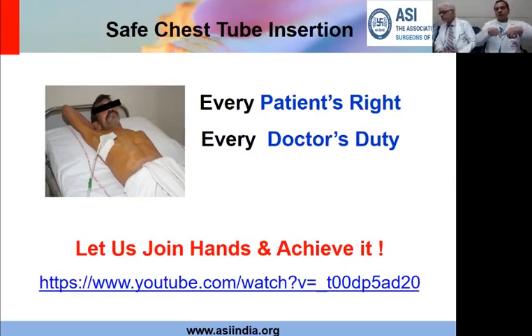Sometimes when you take this loop and you do the dressing, the angulation may be such that there is some kind of an obstruction occurring. This prevents complete egress of fluid and air and leads to persistence of pneumothorax or hemothorax. But if you have egress completely, ask the patient to cough. Physiotherapy is vital. When the patient takes a deep breath and is able to breathe nicely, the lung expands and pushes the air and fluid out of the cavity.